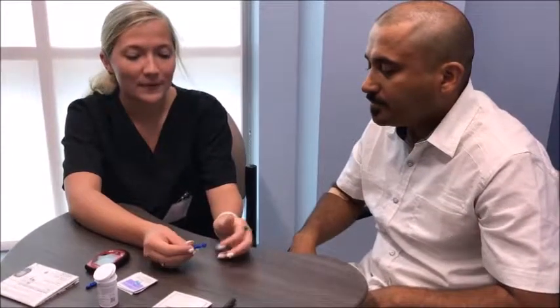And all these lancets are non-reusable, right? Right, they're non-reusable. They also have a sharp end, and in a hospital, they have a container to dispose of sharps, but I'm sure nobody has that at home. What you can do is get a sturdy plastic container, like one from laundry detergent or even an old water bottle, and put these in there, and then you can bring them here and we'll dispose of them properly. Because it is dangerous, especially with kids and pets around, to have this in a trash can. Somebody could stick themselves. So I think that's pretty much it about the lancets.